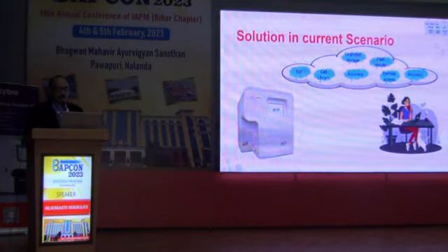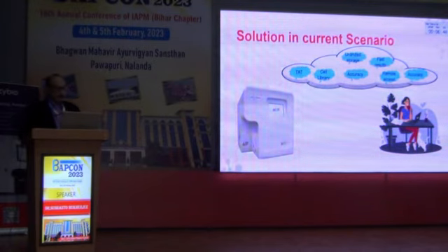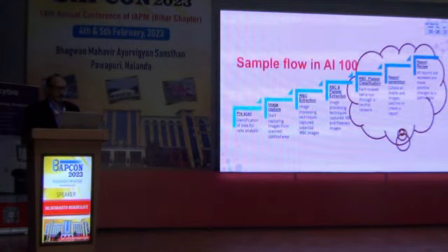accuracy, faster results, remote access. By cell library, I mean that if I get stuck somewhere, I used to go through the books or consult my senior by sending the slide: "Sir, please identify the cell. I failed to identify it." In this case, you have a cell library.